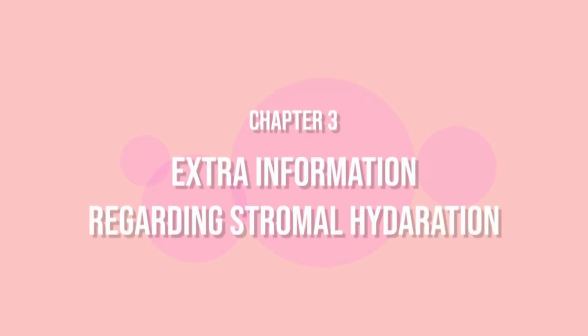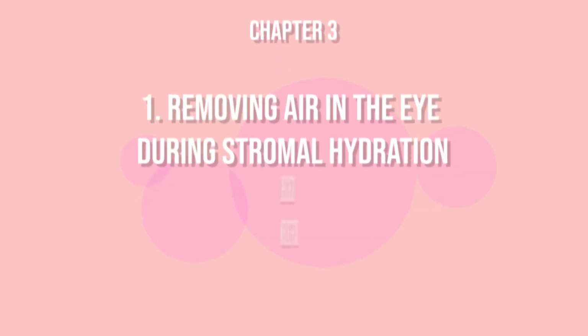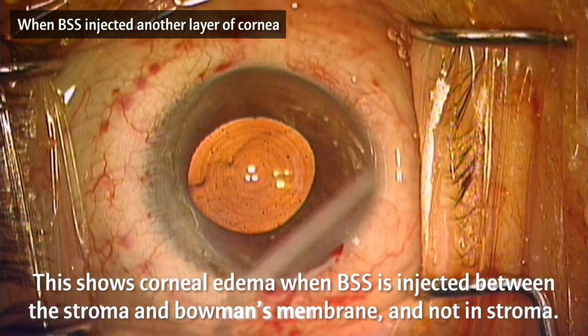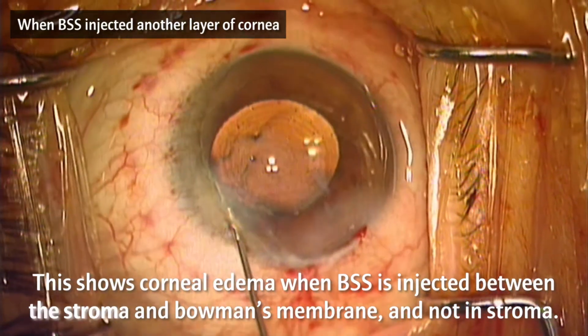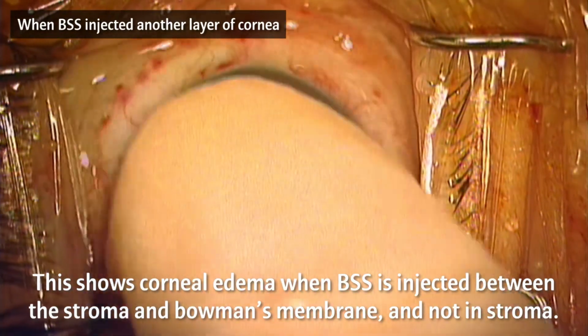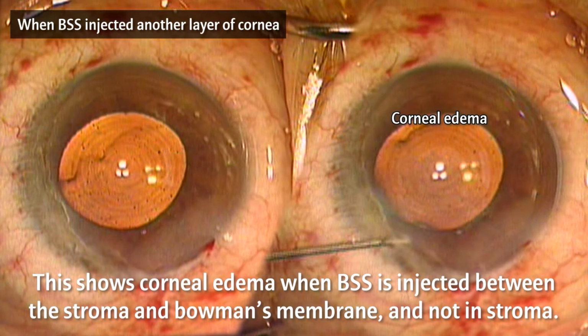Next, let's see what happens when BSS is injected into different locations during stromal hydration. BSS was injected in between the stroma and Bowman's layer, resulting in corneal swelling. However, you don't have to worry because the cornea will recover within 2 to 3 days.